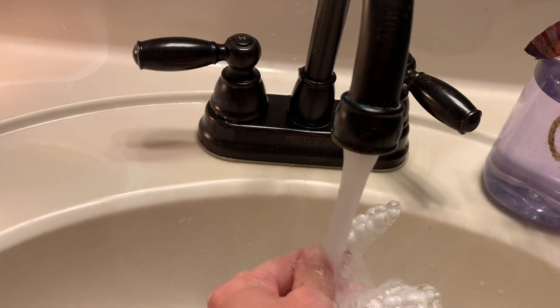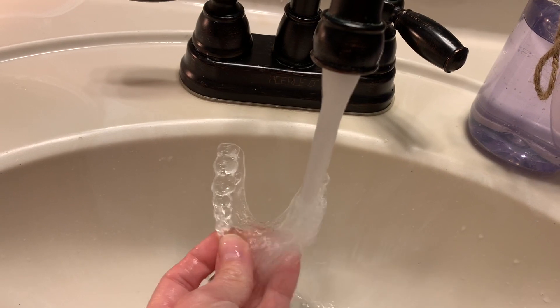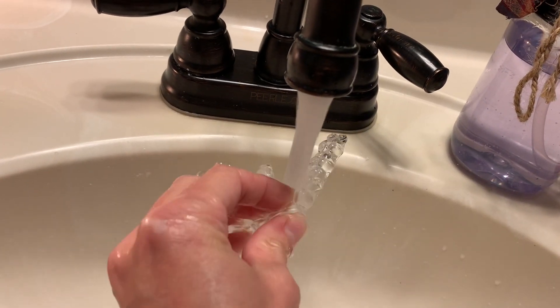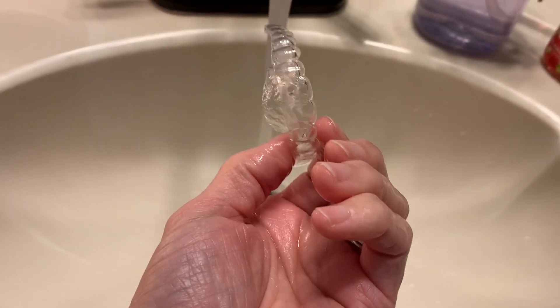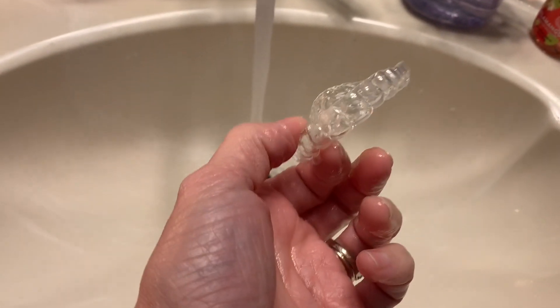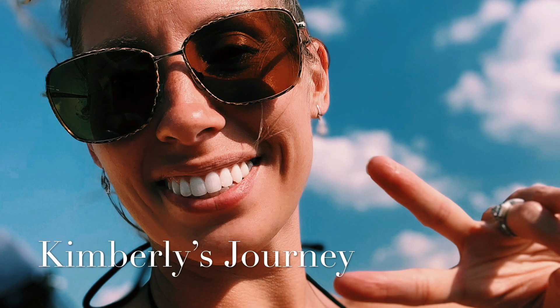Once you've done that, rinse your retainer under cool water to get all of the mouthwash off, then place it back in your case — or if it's ready for use, go ahead and pop it in. This deep clean will keep your retainers nice, clean, and clear for a while. Thank you all so much for watching, I hope you found this helpful and informational. Hope to see you back here soon — bye!